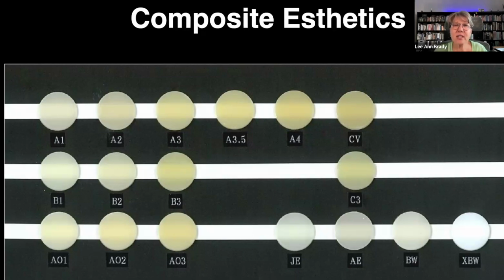So they still have 3 composites that have the same relative opacity and translucency, but they give them totally different names, right? In the Genial Sculpt, the opaque is the equivalent of the dentin in Empress Direct. The dentin shades are the equivalent of the enamel shades in Empress Direct, and the enamel shades are the equivalent of the characterization shades. So you have to know your system.